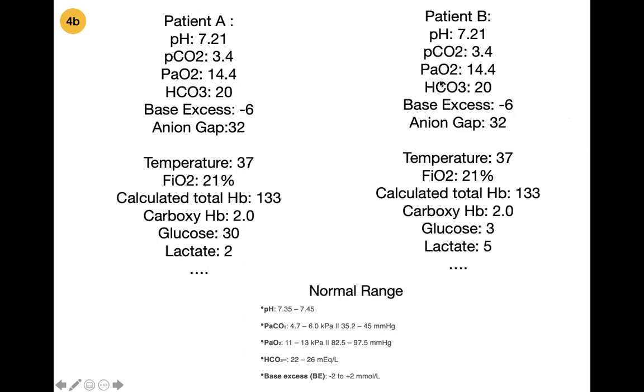We already talked about the beginning, the first half, very similar. So we've got metabolic acidosis. Scrolling down, fine with our glucose, and it's good to check that they're not low. Lactate, all worrying: sepsis, lactic acidosis. Start in your OSCE to bring this all together, saying we've got a metabolic acidosis with a high anion gap. Our respiratory function's okay, but we're not managing to compensate for this acidosis, so it needs treatment. And we know the cause. This is lactic acidosis.